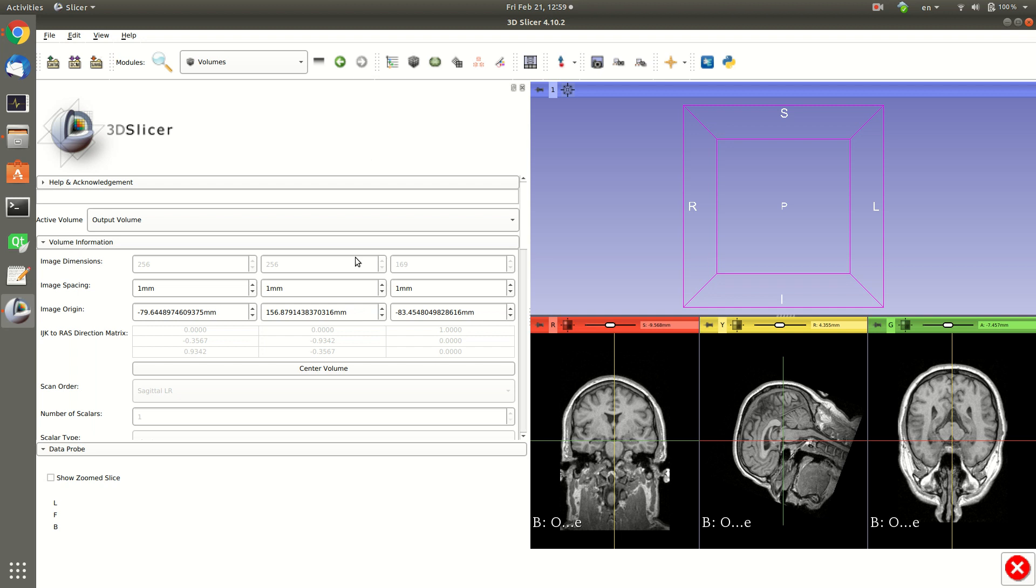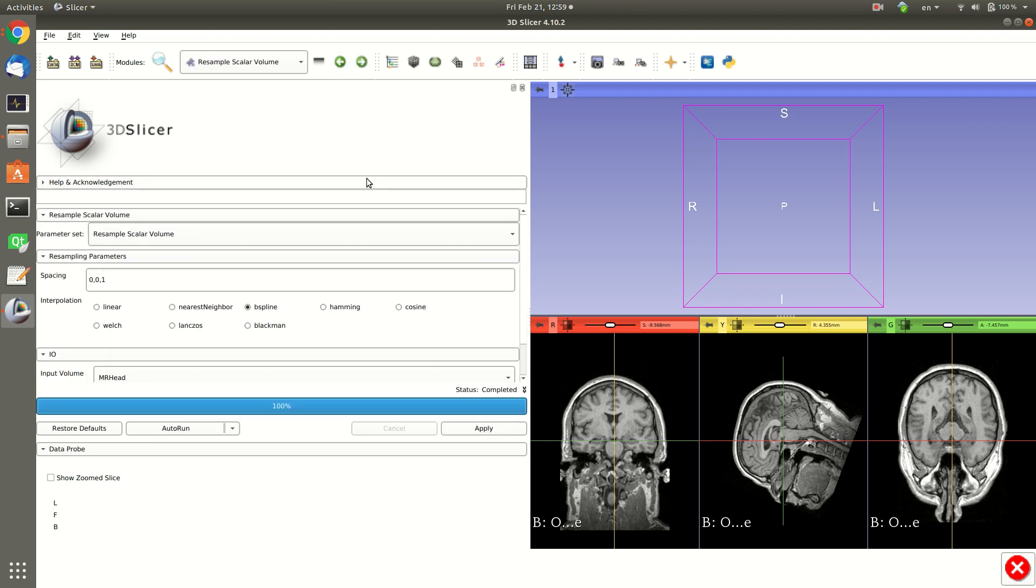So instead of increasing we decrease. If we have one I can create for example 0.5. This will give us smaller size image but the quality of the image will decrease.